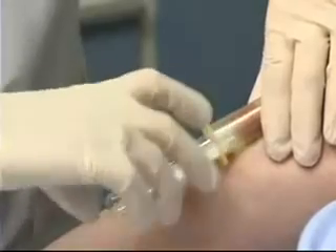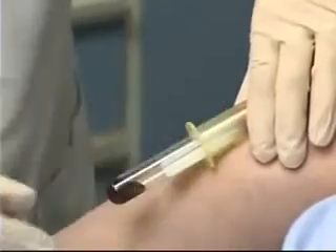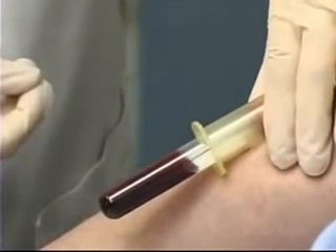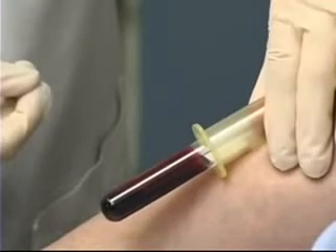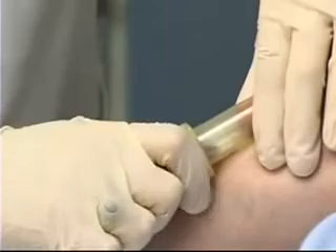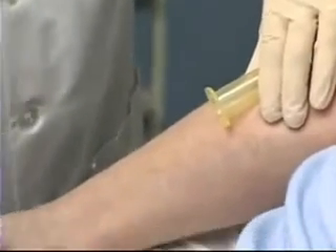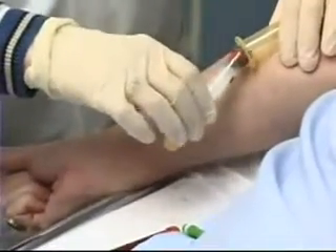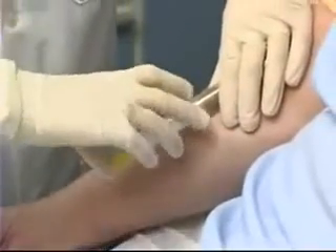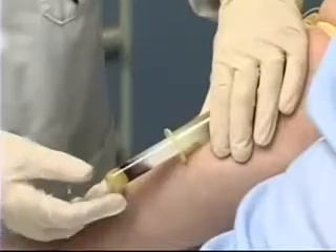That enables me to push the tube into the needle, creating the vacuum and allowing the blood to flow. Once I've filled that tube adequately, I can pull it out of the holder, giving it just a little shake. Taking the second tube and again pushing the tube through the needle.